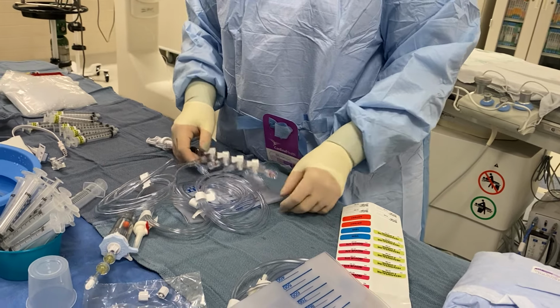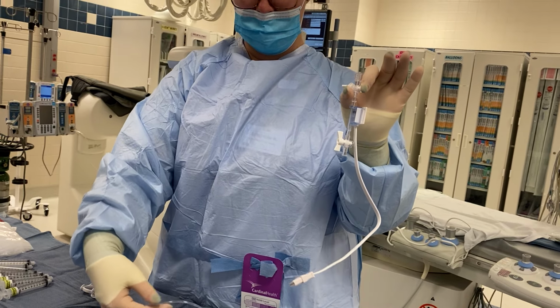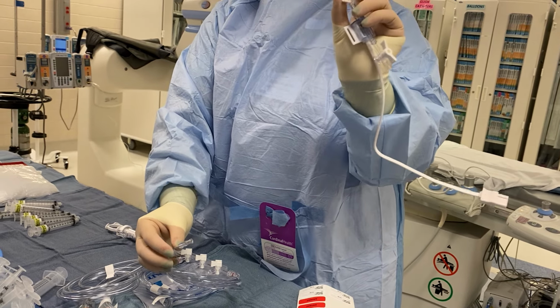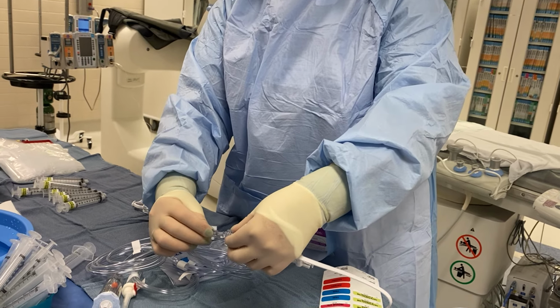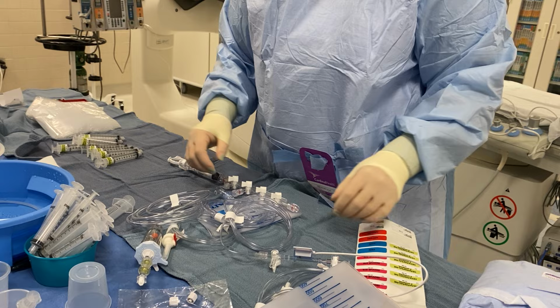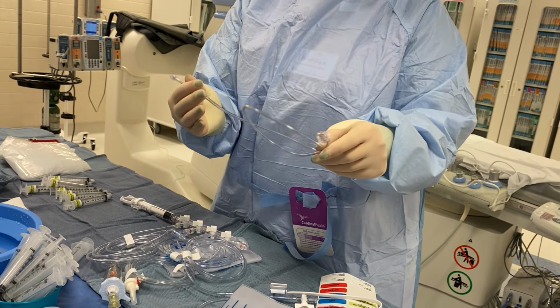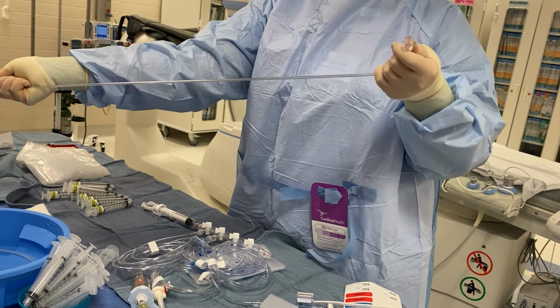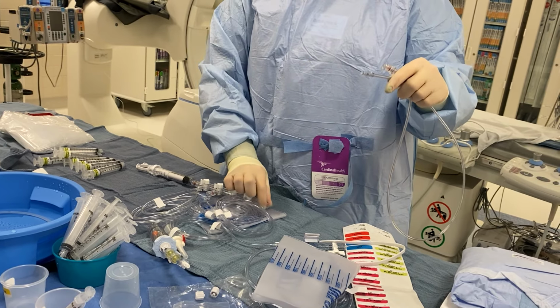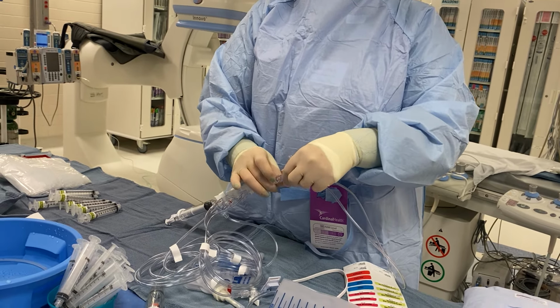And then we also need to connect our transducer to our pressure line. And this one as well, it can only connect one way. So we have our male end here and our female end here. And the two are just gonna twist together. And then we have some extension tubing. This just allows the doctor to stand a little farther away from the patient to reduce their radiation exposure. And this is just gonna connect right on the end. Again, we have the male end and the female end, and the two are just gonna go together, just like that.